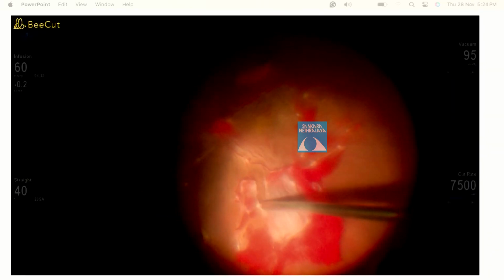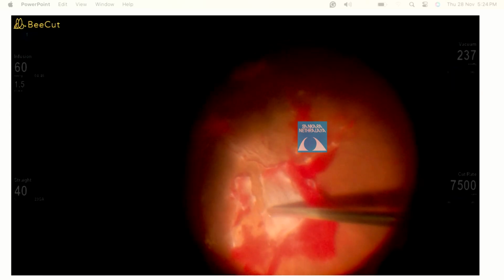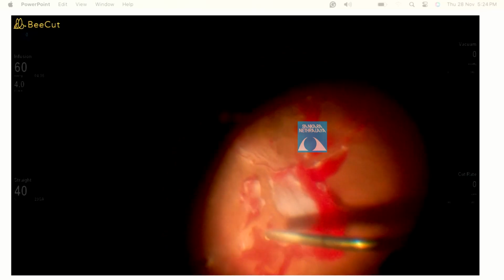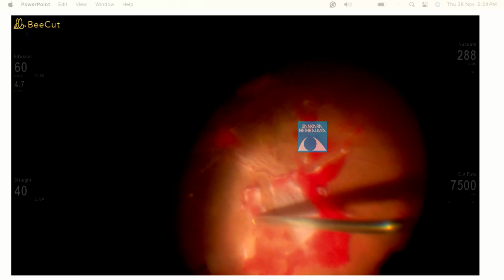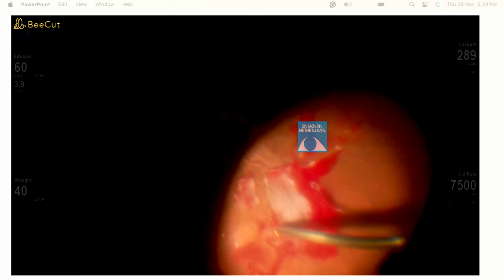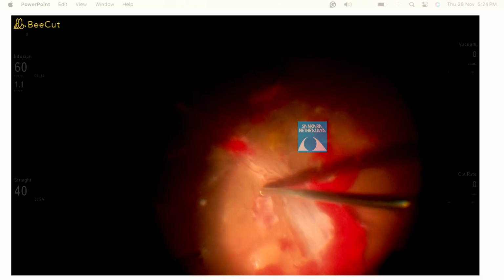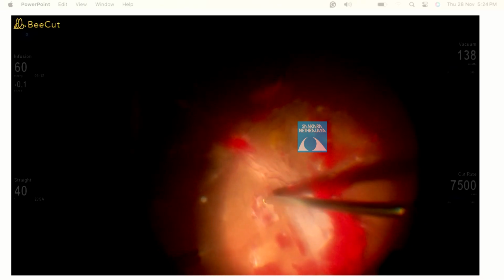Next is a conformal cutter delamination. In this, the thickened membranes are there. It involves dissecting the thickened membrane directly by moving the cutter port into the leading edge of the membrane. We have to adjust the cutter away from the retina so as to avoid the risk of retina entering the port.